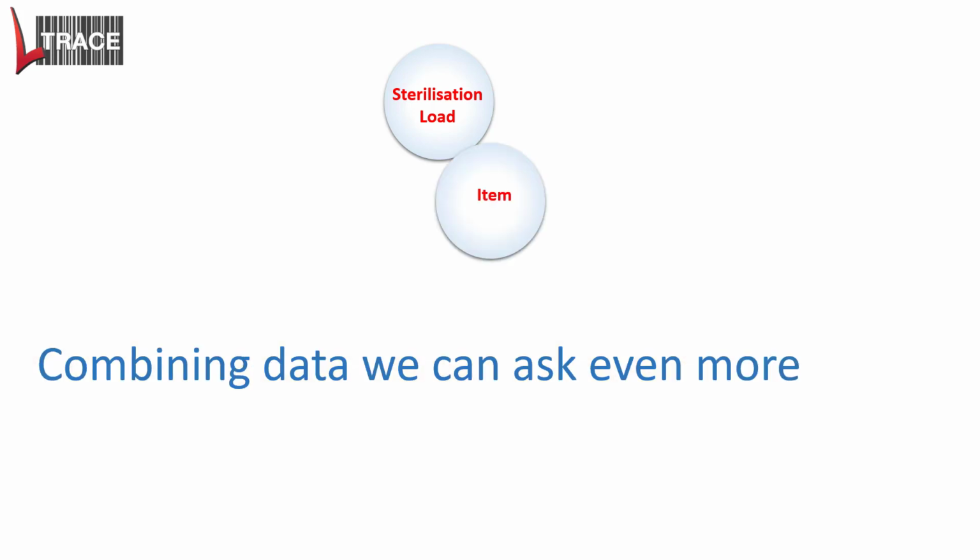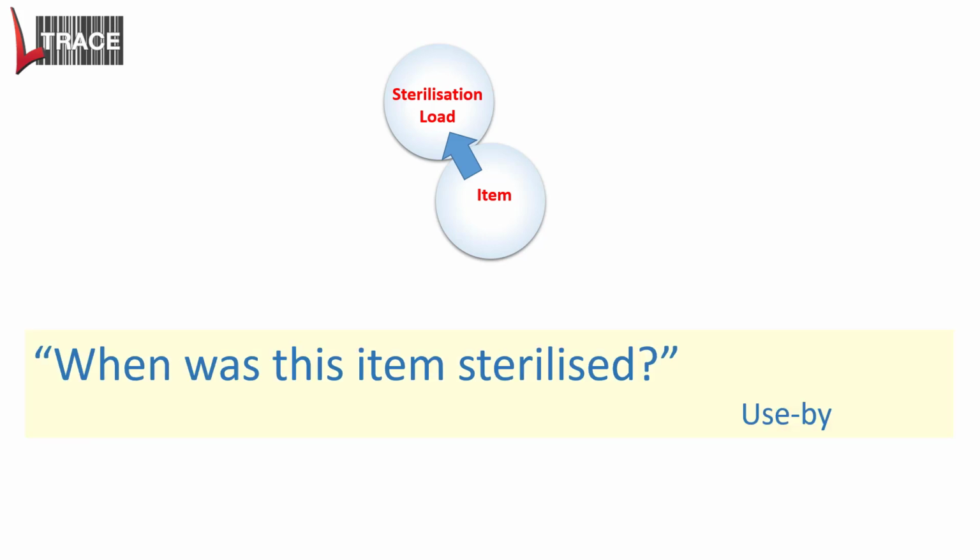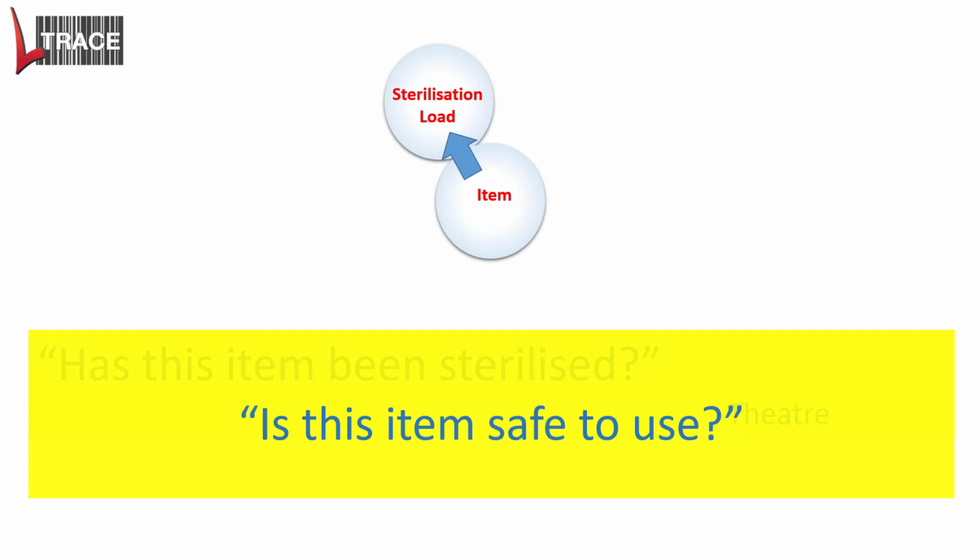But now let's start to get slightly fancier. Let's combine data from two different sections. Let's combine sterilisation loads with the actual item. For any item, since it's linked to the load, we can start to ask questions like, when was this item sterilised? And that's really good for use-by information. And getting back to the most critical question of all, is this item safe to use?